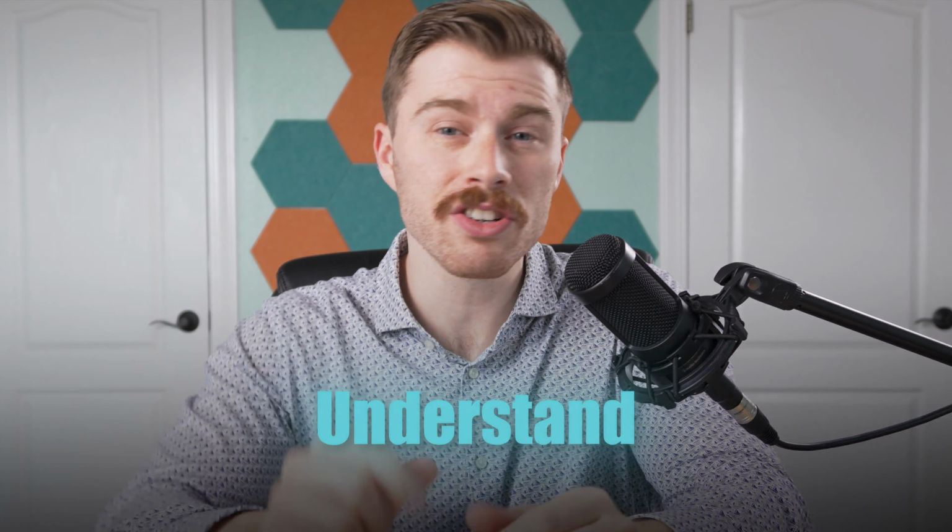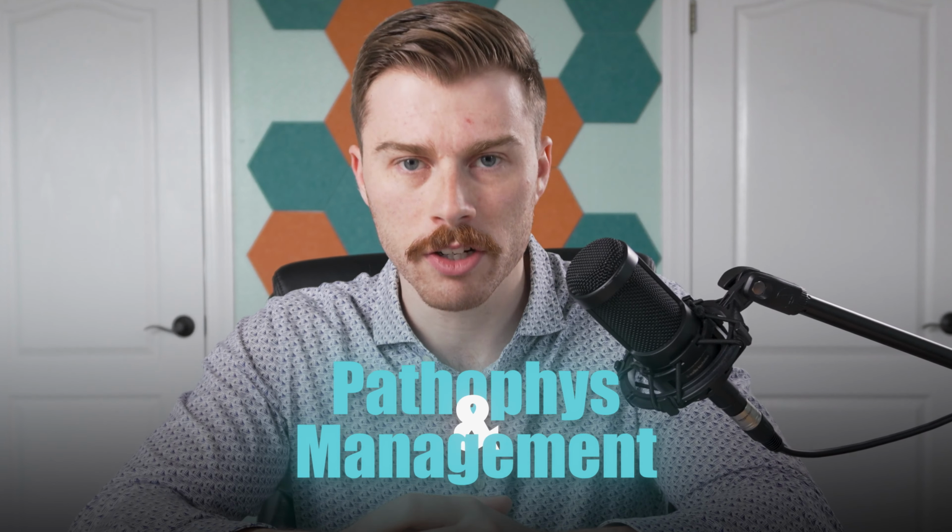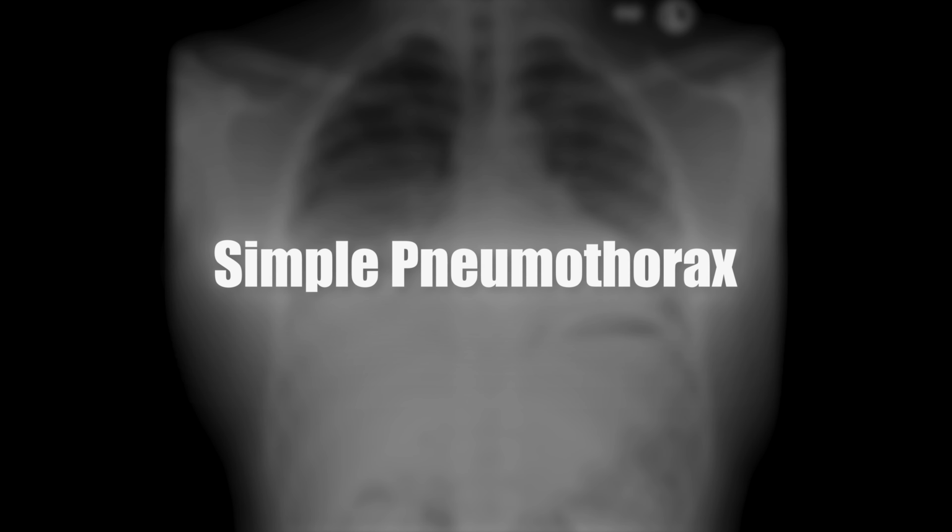I'm Dr. Lucas, former medical school professor, DO, and full-time board prep tutor. In this video, I'm going to show you how to recognize every single one of these images and, more importantly, understand the pathophys and management for each. Let's get started. First up is a simple pneumothorax.